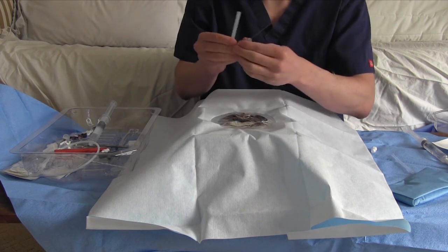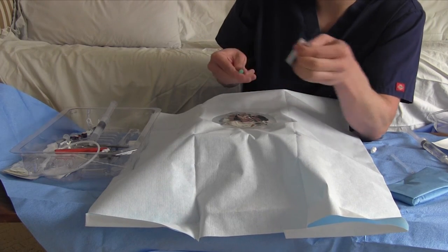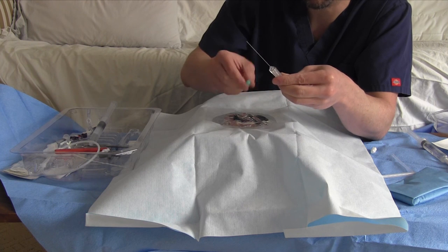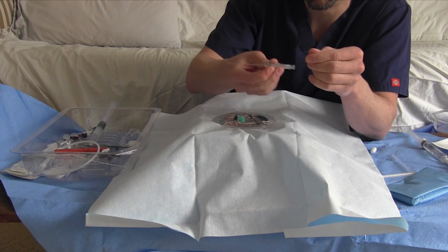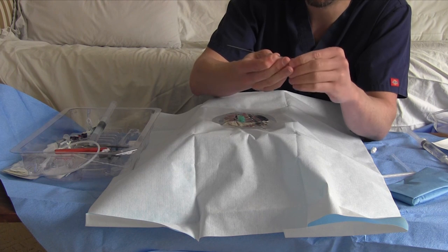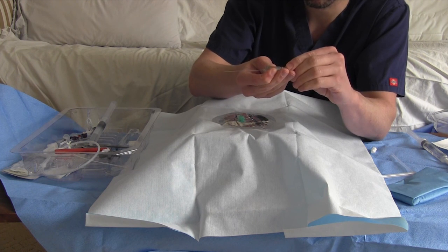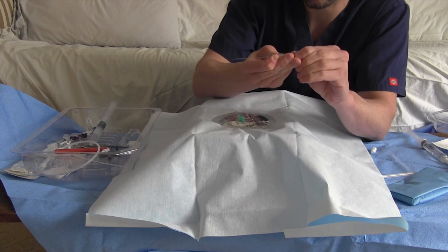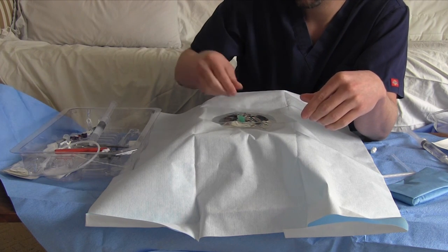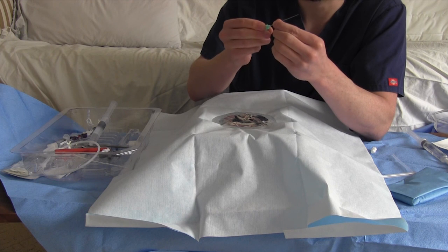You have a choice of two needles. They're both essentially the same. One is non-safety and one is safety. This is the safety one, which I don't use. I prefer to not have the added bulk and such. But with the safety one, once you have the wire through it, you could actually turn and pull, and now it's permanently locked. This is just your standard non-safety needle.